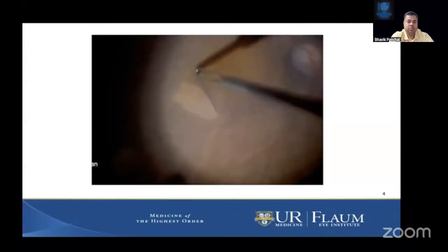When you're doing regular vitrectomy, you can use a wide angle lens. But for macular surgery, you need a high magnification. You can use the different lenses available, but I would say contact lenses are the best, both for beginners or even for advanced surgeons. Any day, a contact lens is a better lens for visualization.